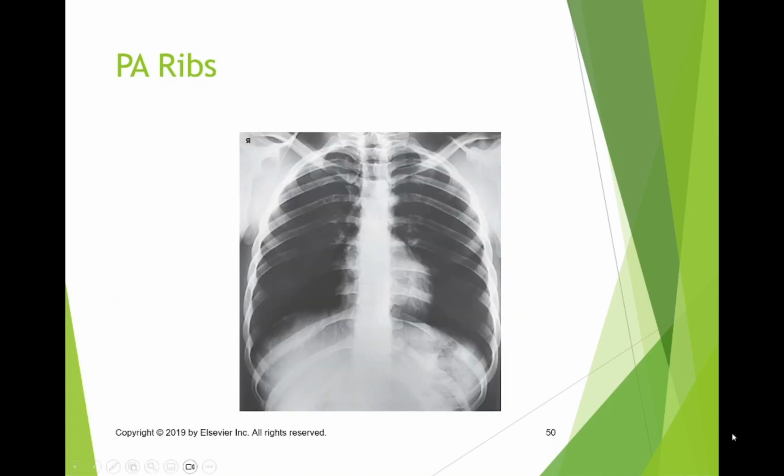So what you should see is this. From this, we can gather a number of different things. You can count the ribs if you want to, but what we want to see in ribs and bony thorax in general is high contrast. And we do see it here, but we also see in these ribs in the lower portion, they're kind of burnt out a little bit. And I think that's probably because these are old images from screen film radiography. Your computer algorithm should give you the dynamic range so that you could better see those ribs.